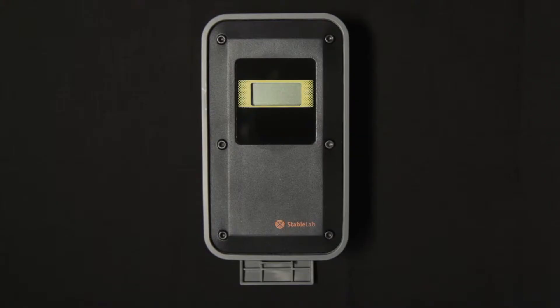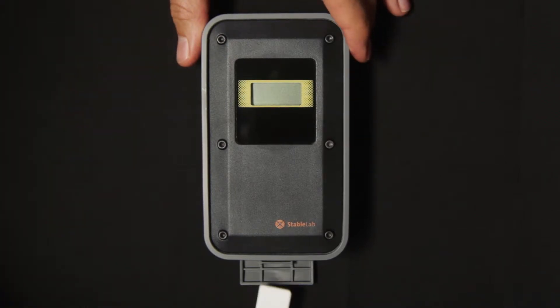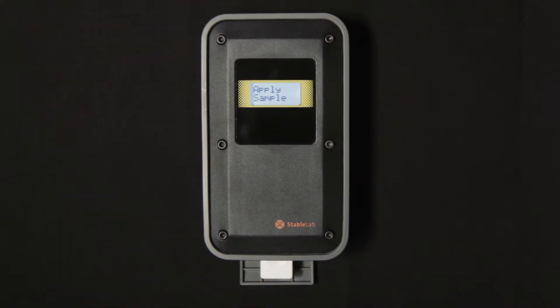The reader is designed to make it as simple as possible for the busy veterinarian. There are no buttons — you just insert the test cartridge and the reader will automatically power on. The message on the screen should say 'apply sample.'